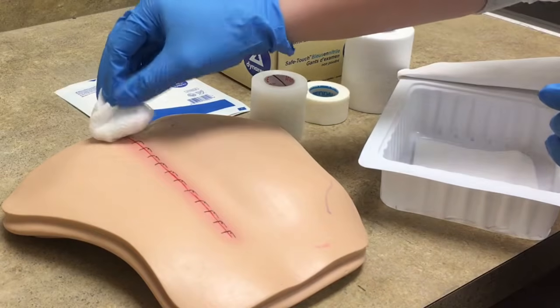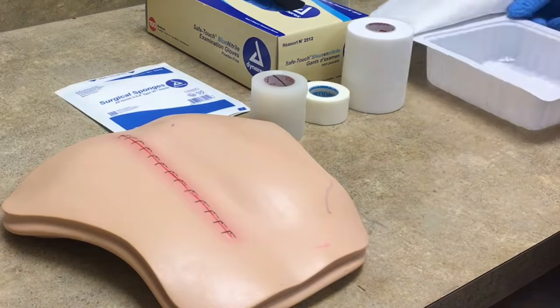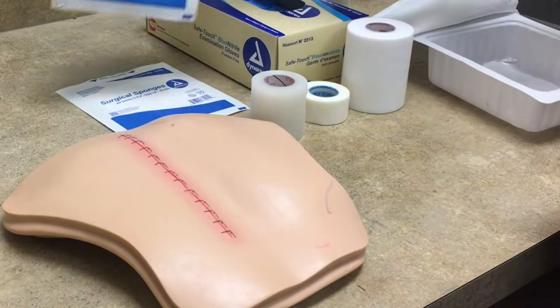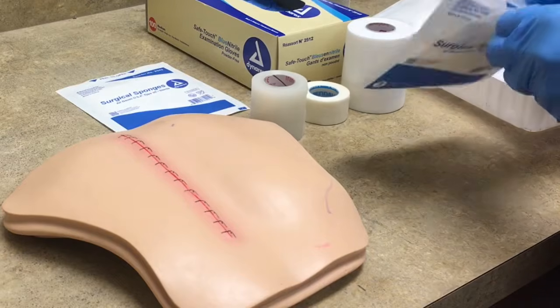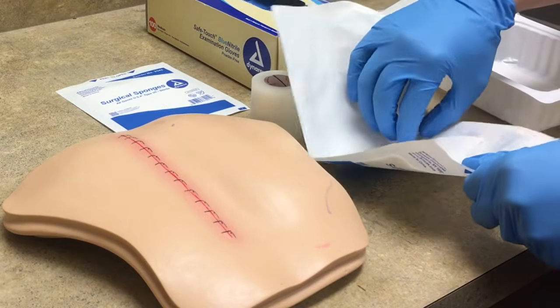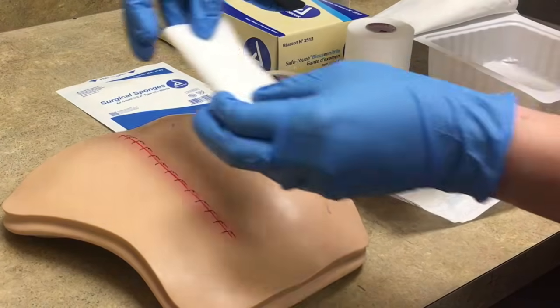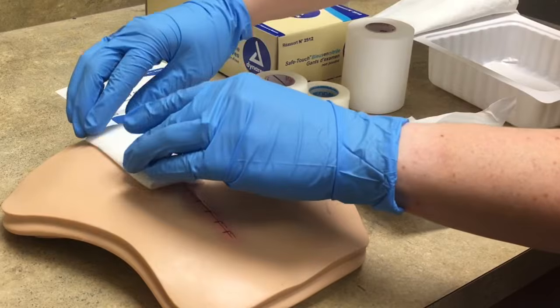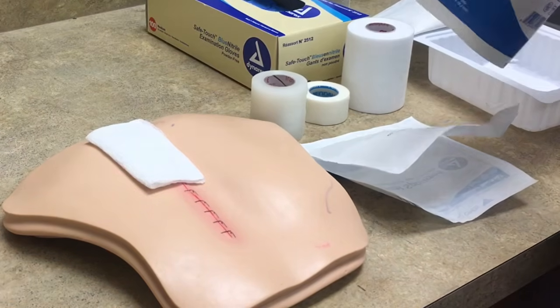Once we have cleaned this area appropriately, we will then dispose of what we don't need, and we will open our surgical sponges, which again are just 4x4s, and we will apply it to our patient per our MD order. As we apply our gauze, we will secure our dressing.